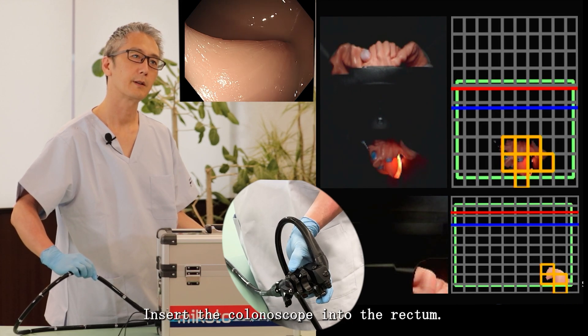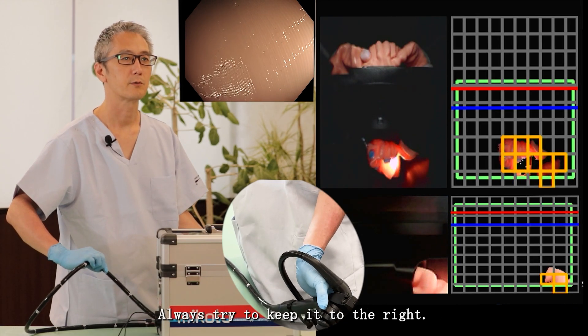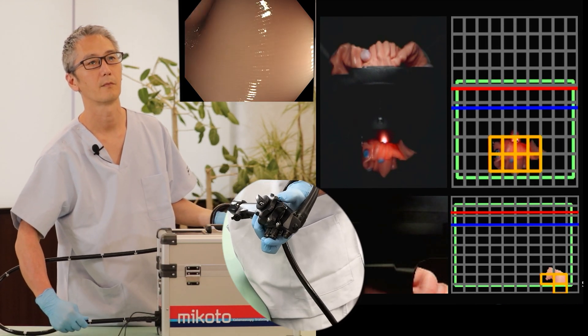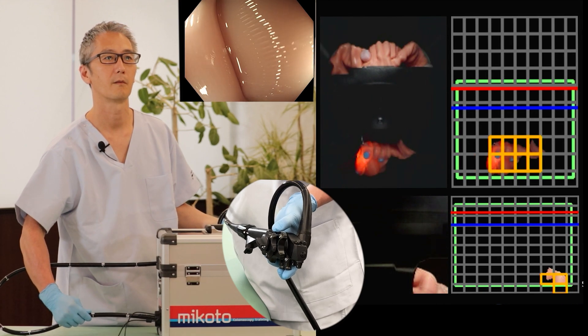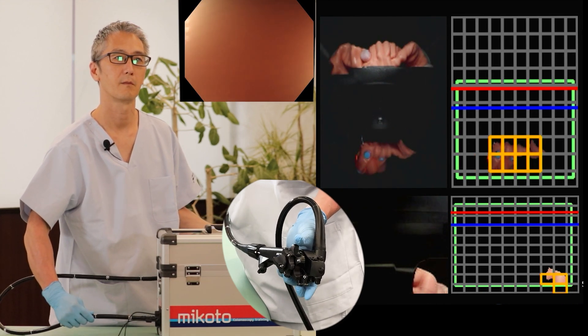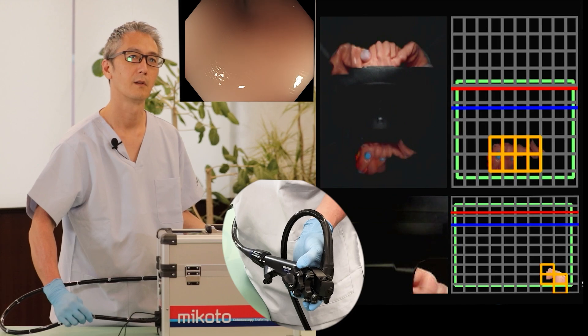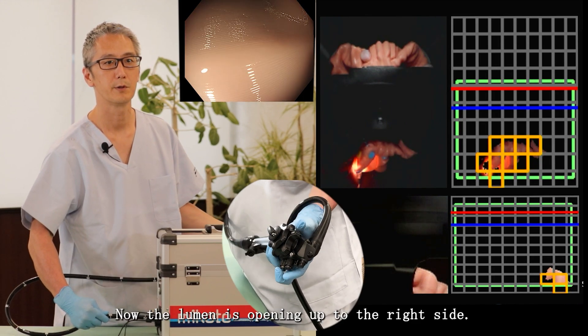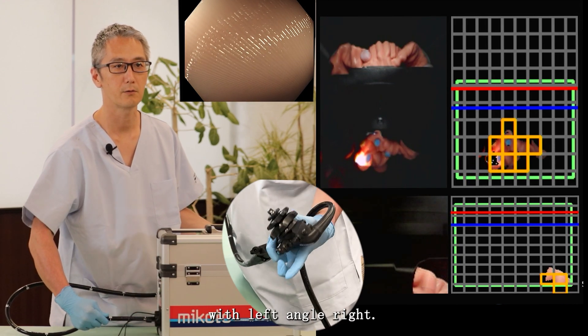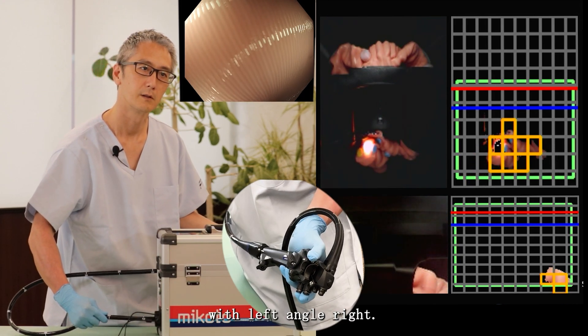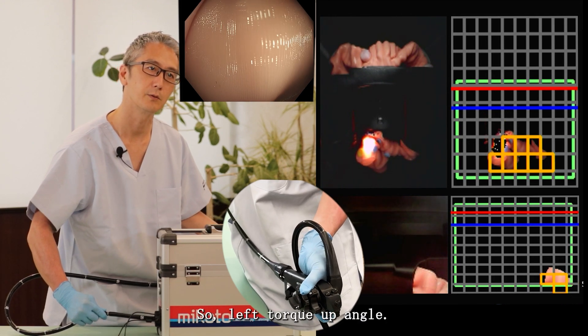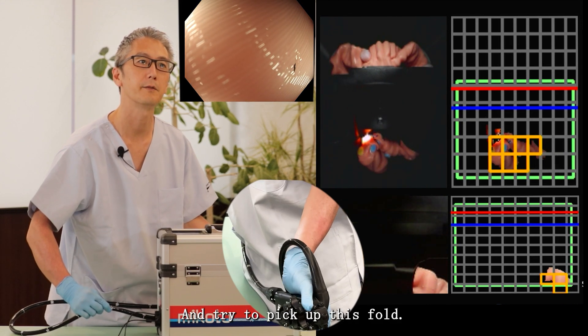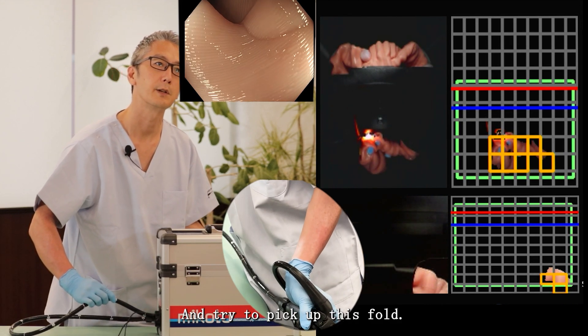Insert the colonoscope into the rectum. Always try to keep it to the right. Now the lumen is opening up to the right side with the left angle. Now it's coming to the left. So left torque, up angle, left hand. Try to pick up this fold.